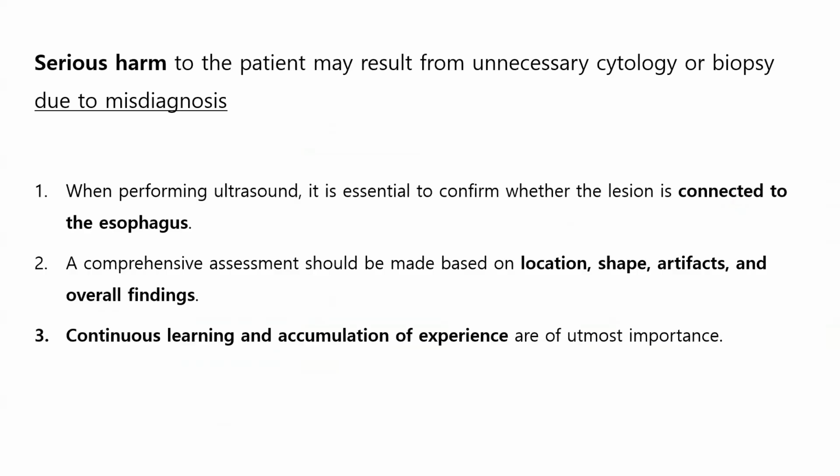In conclusion, ultrasound diagnosis heavily depends on the examiner's attention to detail and prior knowledge of the disease. Esophageal diverticula are frequently misdiagnosed as thyroid nodules or parathyroid lesions. When misdiagnosed, unnecessary FNA or biopsy may cause serious harm to the patient. Therefore, always assess for connection to the esophagus, and consider the location, shape, artifacts, and all imaging features comprehensively.